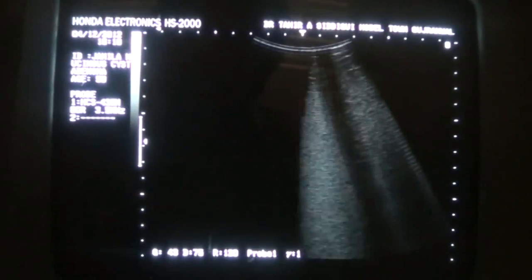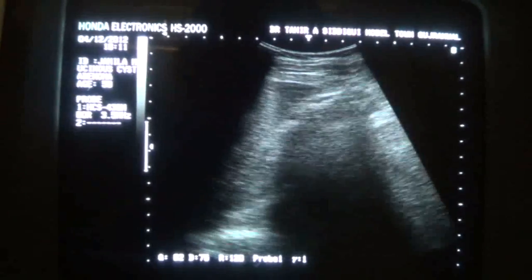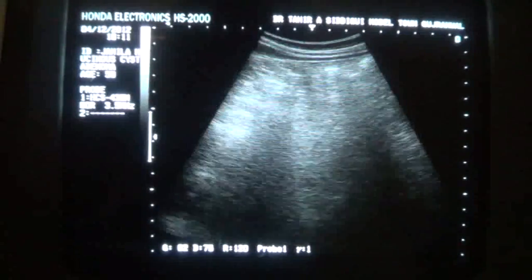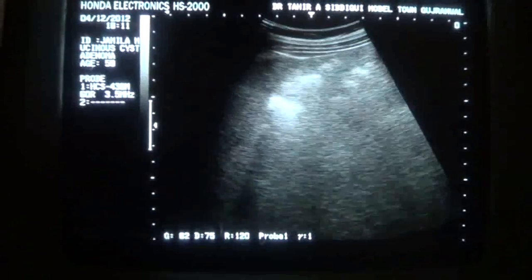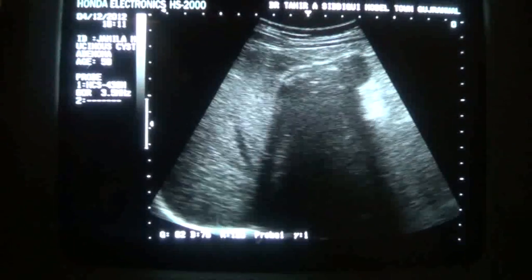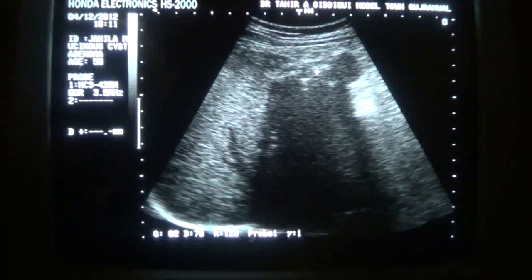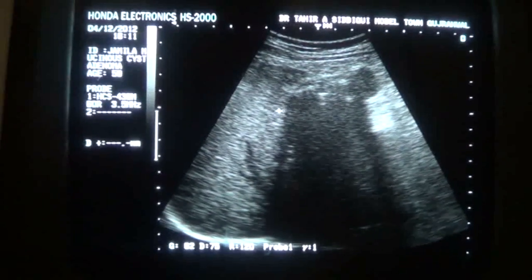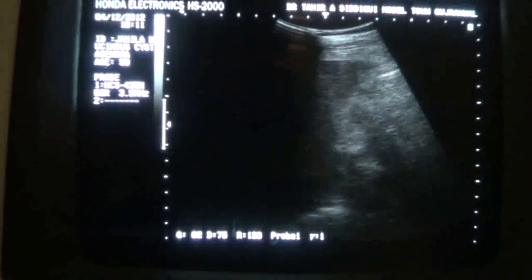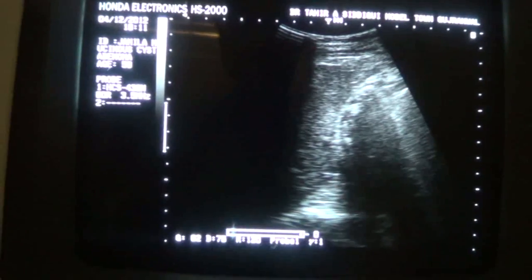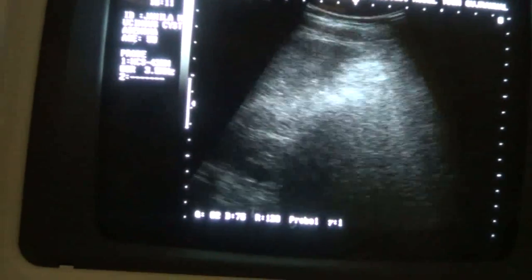Now we have to see whether it relates to the gallbladder. This is the gallbladder — the mass does not relate to the gallbladder. This is the gallbladder, and these are the calculi within the gallbladder. This shadow is from the calculi within the gallbladder. This is the anterior wall of the gallbladder with shadowing from the calculi.